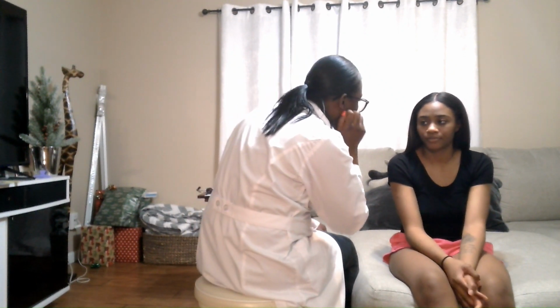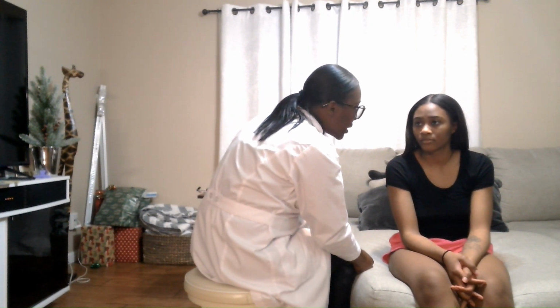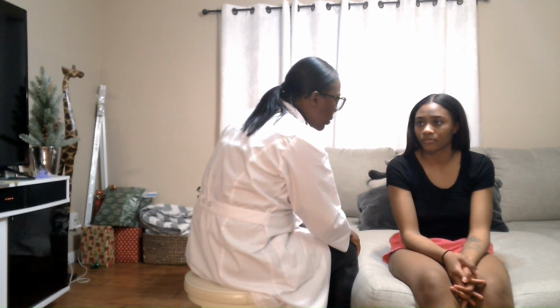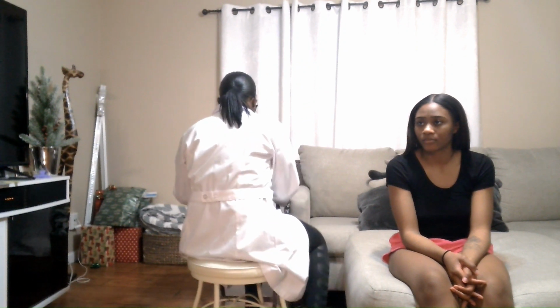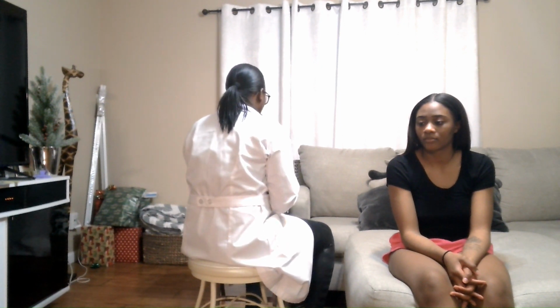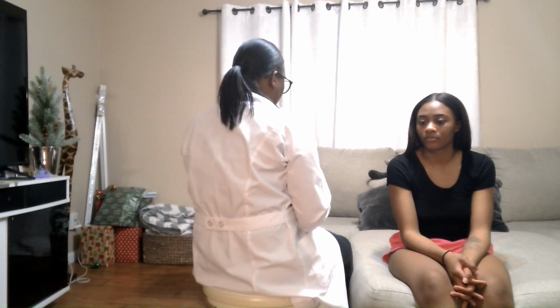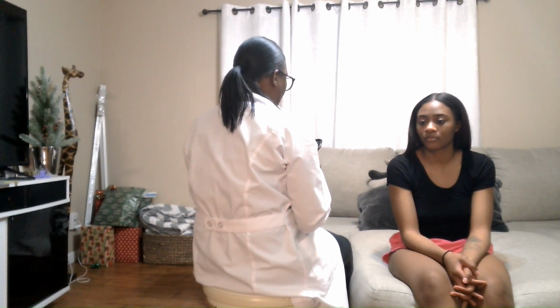While I'm still doing your eyes, I'm going to look at your lacrimal glands and make sure they're normal in size and symmetrical, and no redness noted. The next thing I'm going to do is change to my ophthalmoscope, and I'm going to look at the inside of your eye. Let me turn this on.